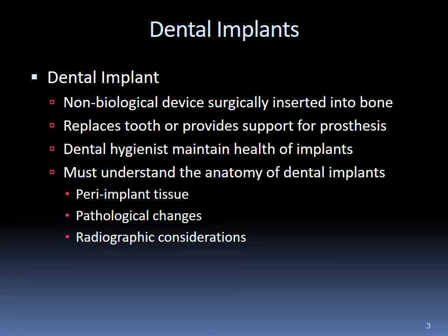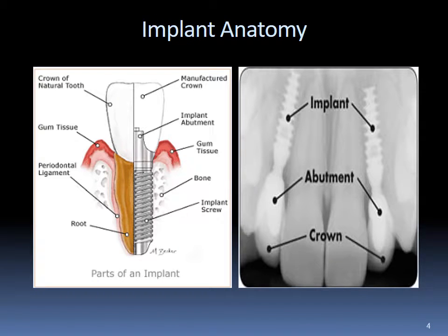The following upcoming slides will be narrated by an avatar. Take a moment to study these images of implant anatomy.